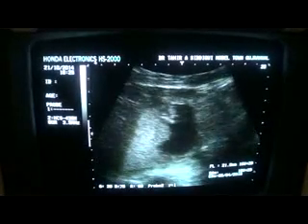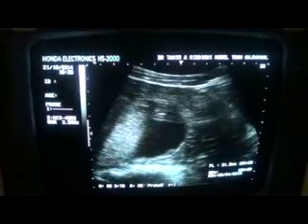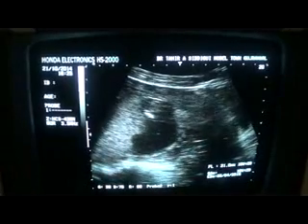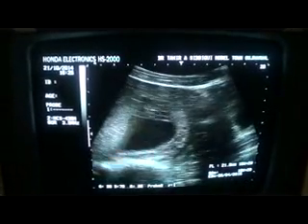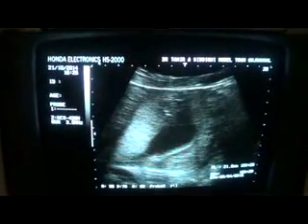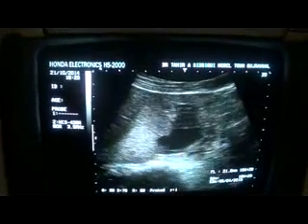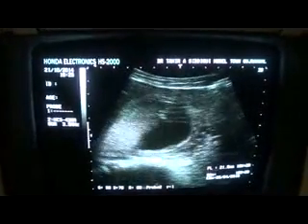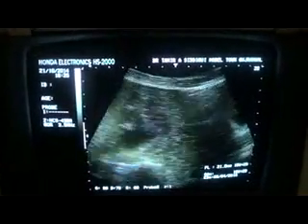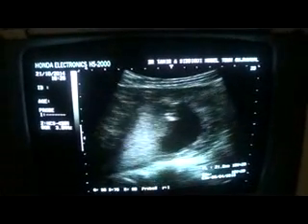And here comes the dilated cervical canal, aligning the vagina because of the protuberance of the abdomen. Fatty patient. Difficult but not impossible.